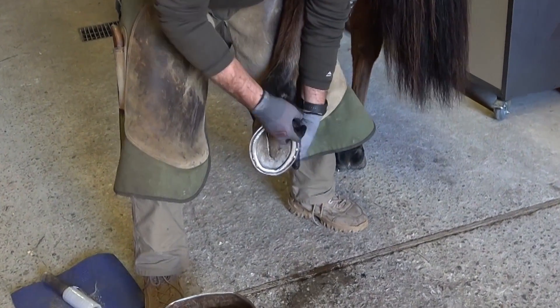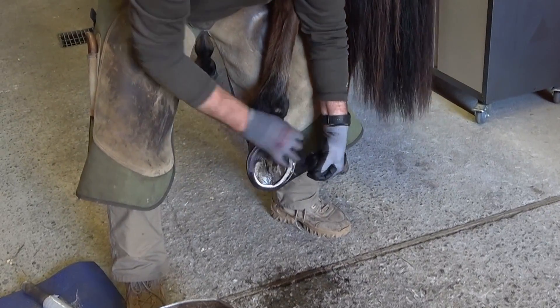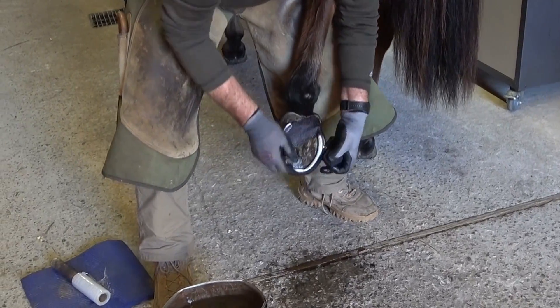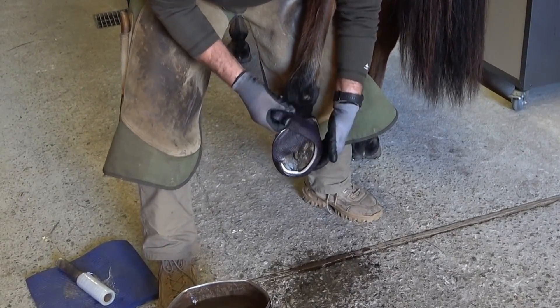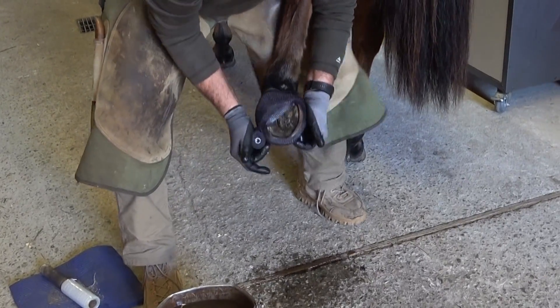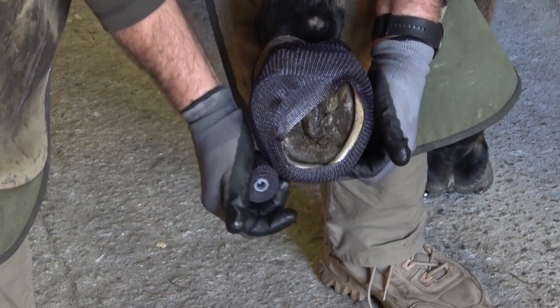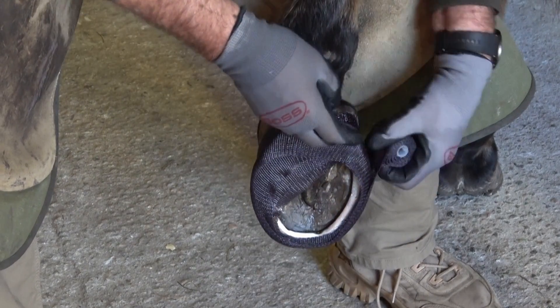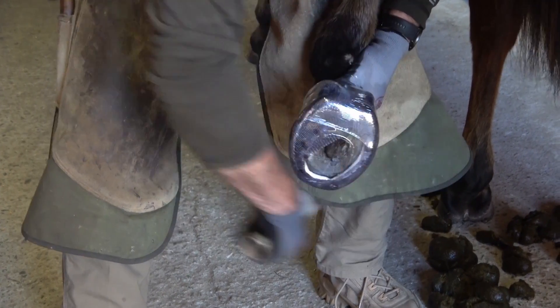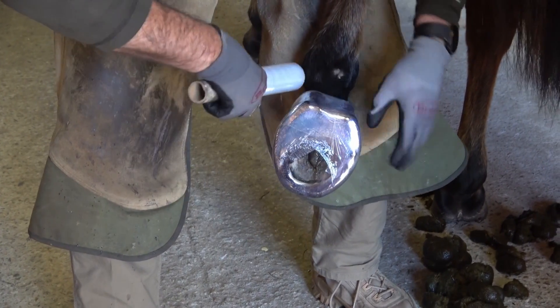Once you have soaked the casting, start your wrap near the coronary band at the heel and then cross lower to the other heel. Continue this X pattern when you make each wrap over the heel. Once you have finished wrapping the cast material, use plastic wrap to lock in the moisture and improve the curing process. Make sure you start with one or two wraps over the heel bulbs before you wrap lower on the foot.